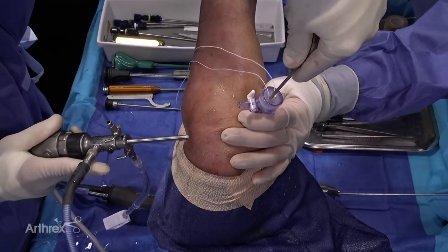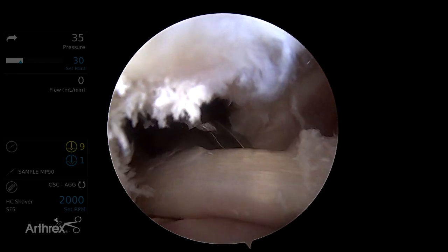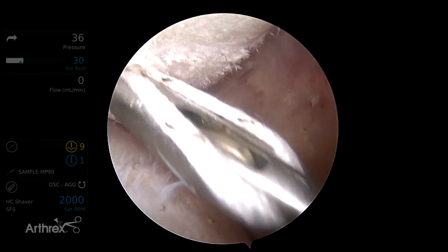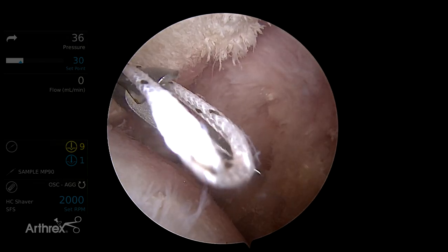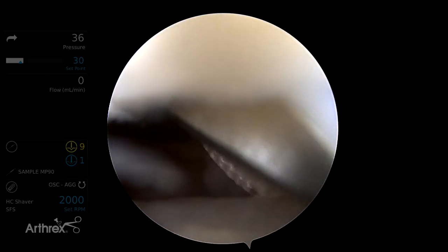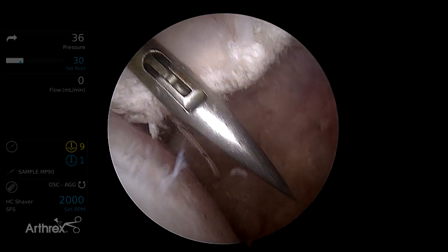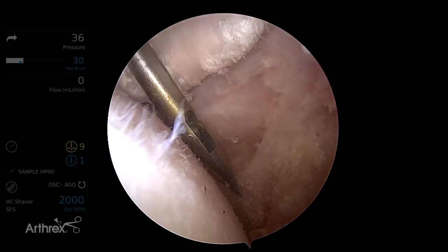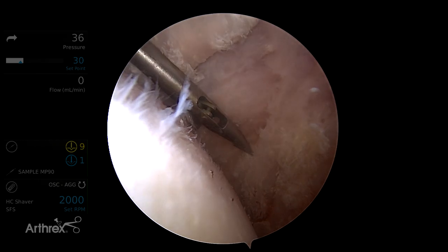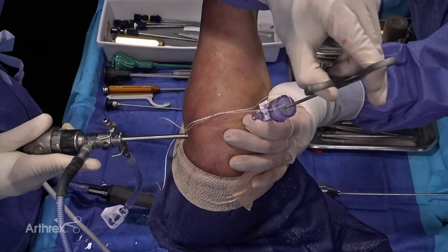My first step, once I've identified the tear, is to place a tagging suture in the biceps tendon. I'm going to load a suture in the middle of a penetrating device, pass through the tendon, drop that loop on the backside, and go back and retrieve it. We want to be careful not to incorporate any soft tissue, but by retrieving that loop out the same cannula, we can then pass the free ends through the loop to create a half-racking suture.